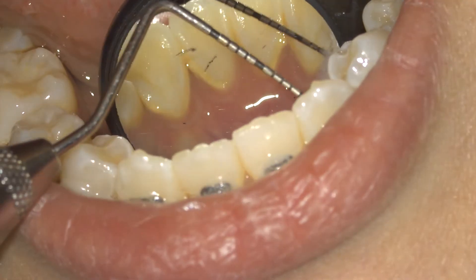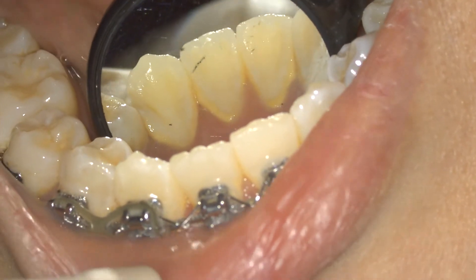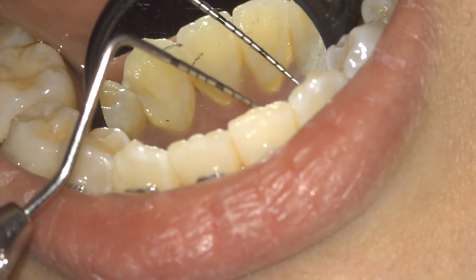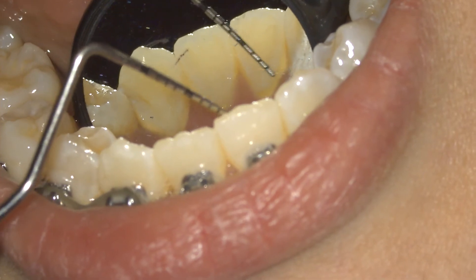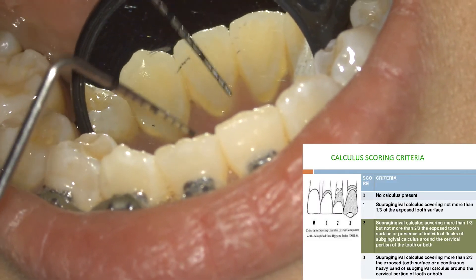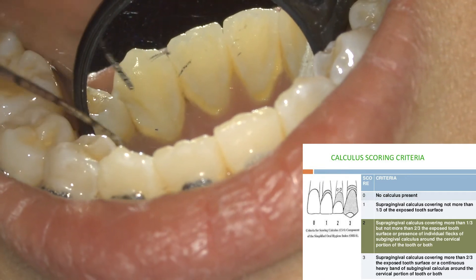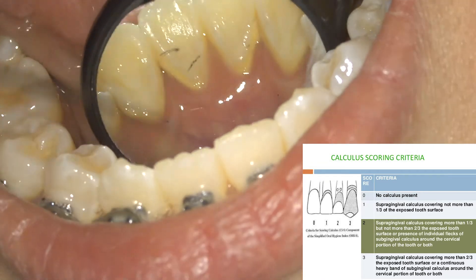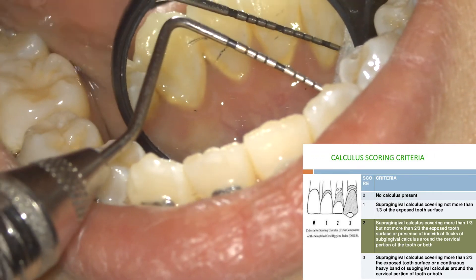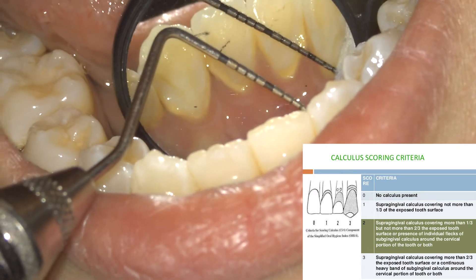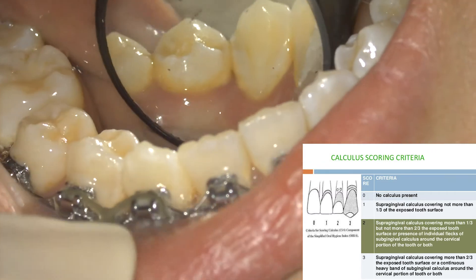Now let us determine the calculus score according to the oral hygiene index calculus component. Is this calculus abundant, covering more than two-thirds? No, it is less than one-third of the tooth surface. Hence the calculus score should be 1 on all these lower teeth. However, if on passing the probe you also find sub-gingival calculus, then you can assign a score of 2.